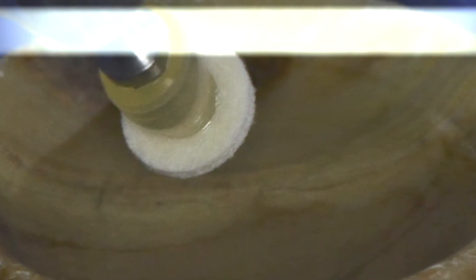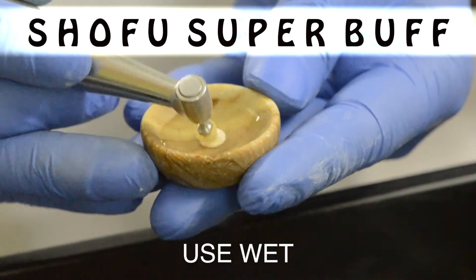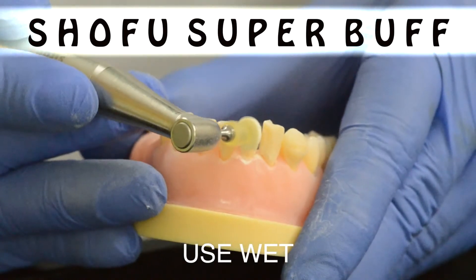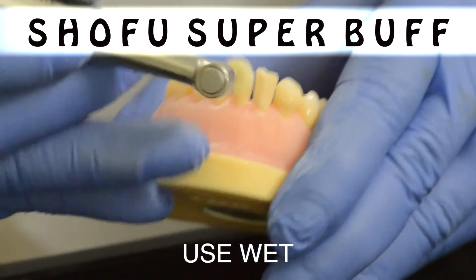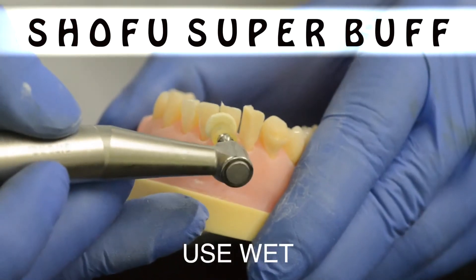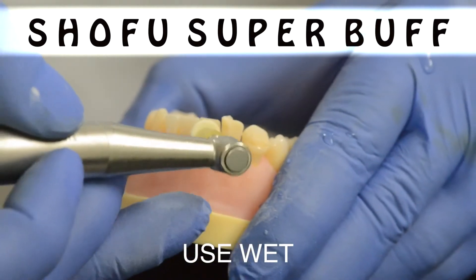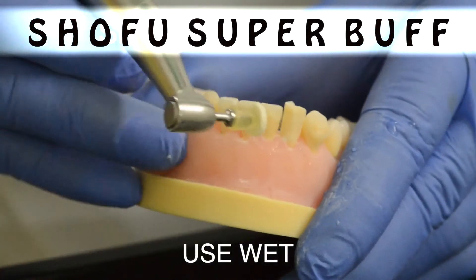We finally arrive at the polishing stage. We begin with the Shofu SuperBuff. It's important to remember that while polishing you always use water. Polish the surface of the composite using gentle strokes with mild to moderate pressure. By the end of the SuperBuff stage you may be tempted to leave the composite just as it is, because the effect you get after finishing with it is quite dramatic.